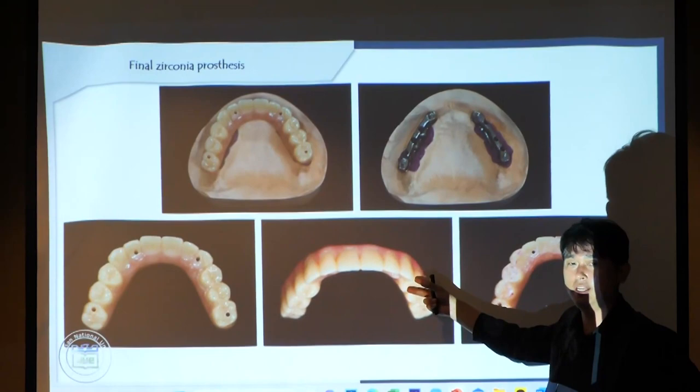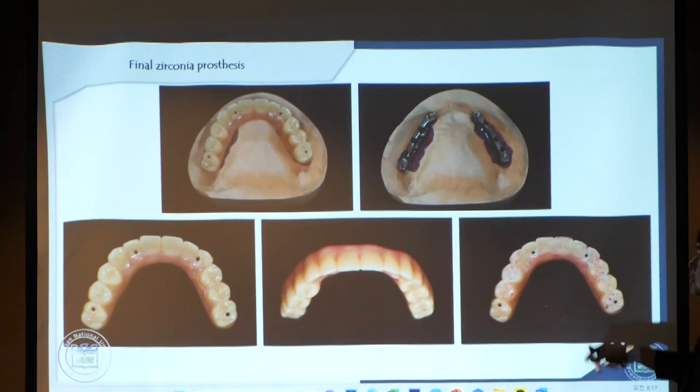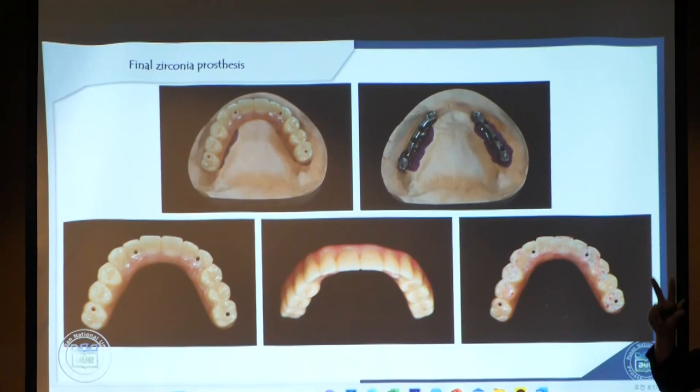They can clean very simply. So if I have another chance, I will introduce that. Anyway, I adjusted the occlusion and then finished it. So totally, the patient visits only 3 times, except for the adjusting time.